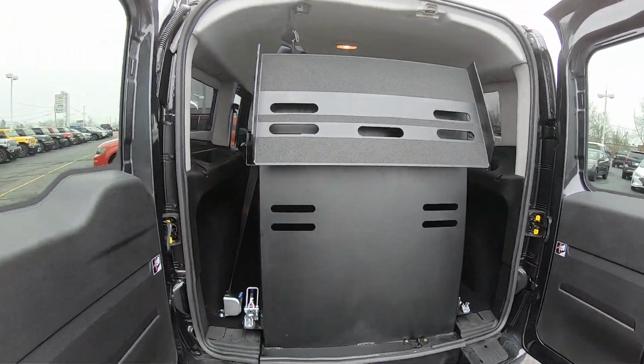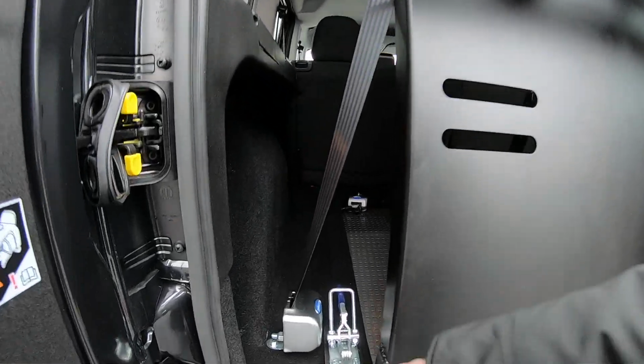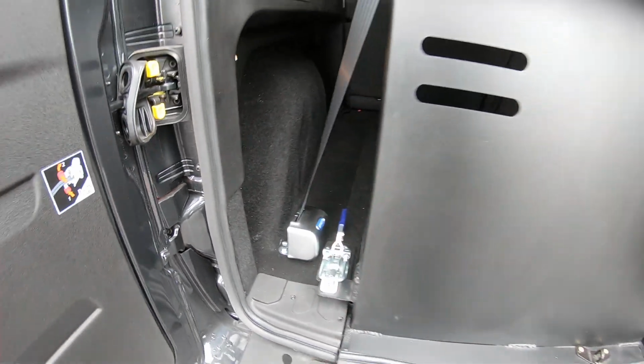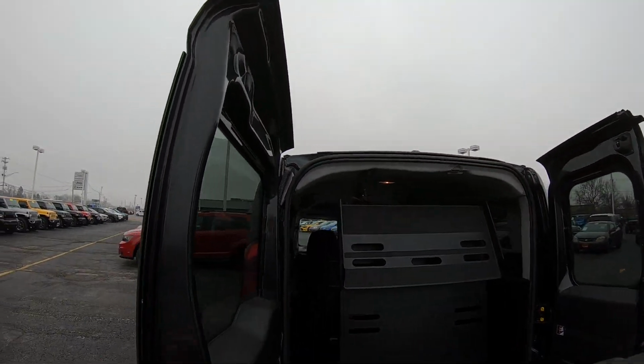One hand, I kept my other hand on the camera, as you noticed, and just popped it right up. And there is locks for this lift. Simply just locks down like that. Oops, sorry. Locks down like that. Very easy concept, and it's secure, just like that.